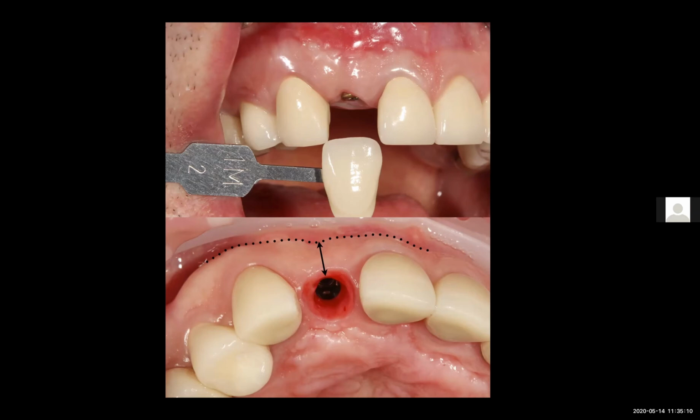And when it's time to restore the implants, we were able to maintain a positive facial contour. And we look at the beautiful implant sulcus. We know that this thick tissue volume surrounding the implants will help protect the underlying supporting bone and also prevent crestal bone resorption that can jeopardize the long-term stability of the implants.